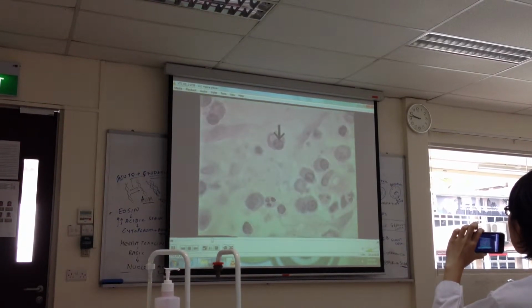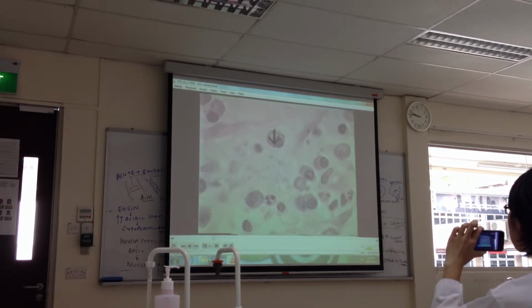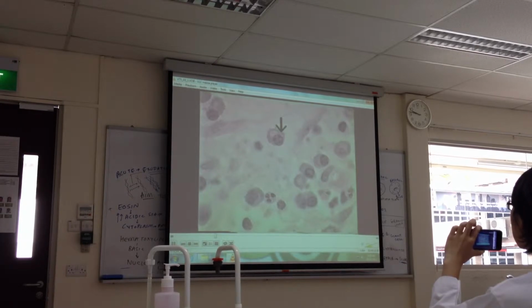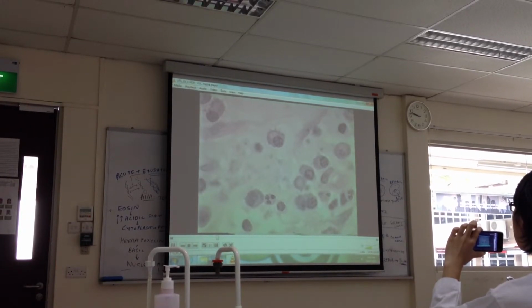This is the nucleus of a plasma cell. It is also round, but the chromatin is arranged in blobs round the edge, just below the nuclear membrane. The cytoplasm is basophilic because it contains lots of RNA, busily synthesizing immunoglobulin. Plasma cells are B cells.